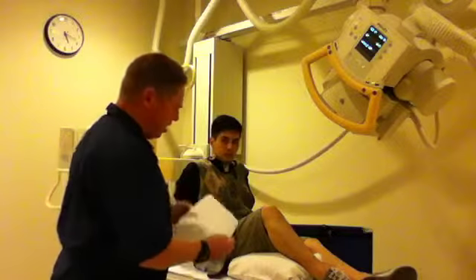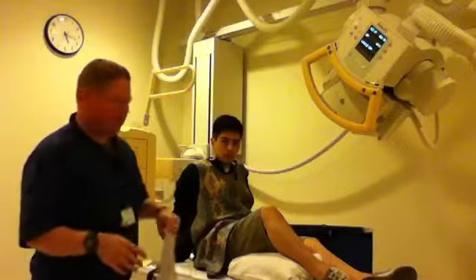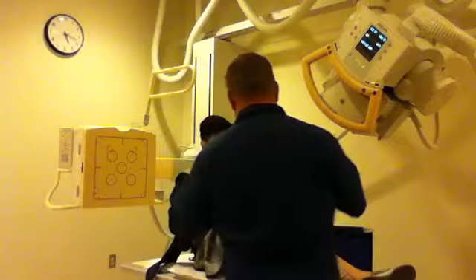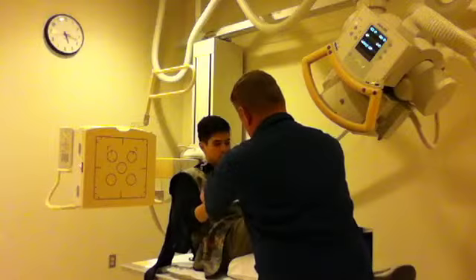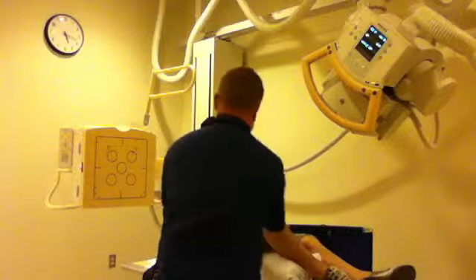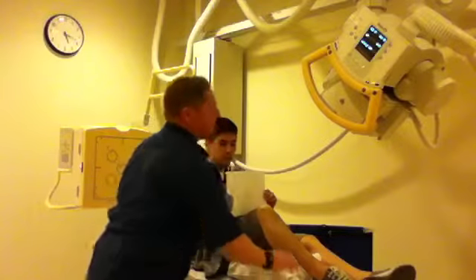And then at this point, since he's already got his leg bent, I'm going to do Sunrise. So I'm going to have him sitting up, since he can do this. Make sure my marker's on there.